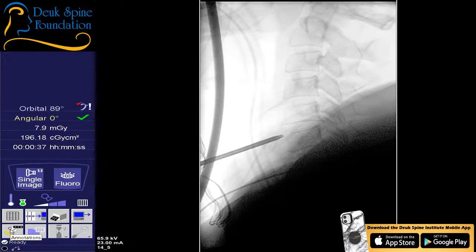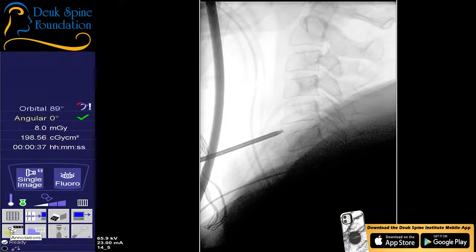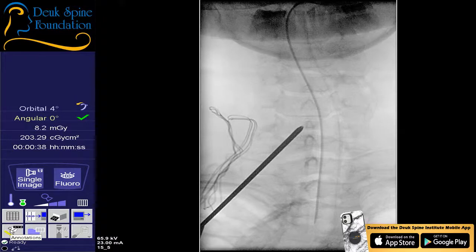All right, it's a little lower than I want it to be. Shot. AP. The lateral looks good again. See the AP. You don't want to move this thing forward unless you're sure where you are. A little bit too much to my side. Shot. Shot. Lateral.